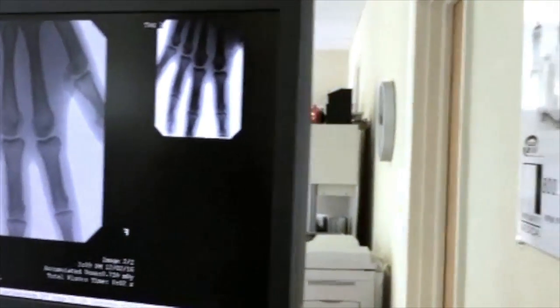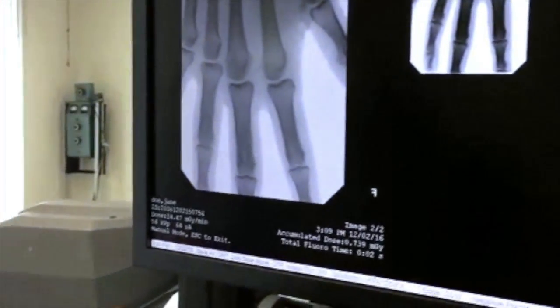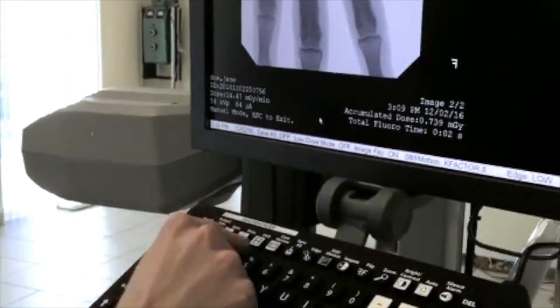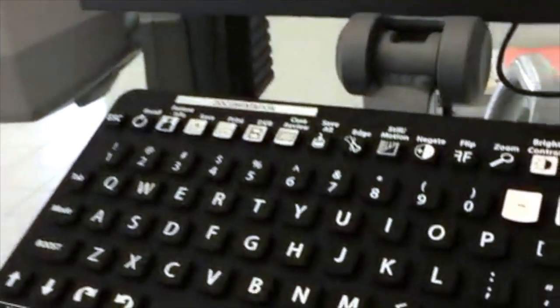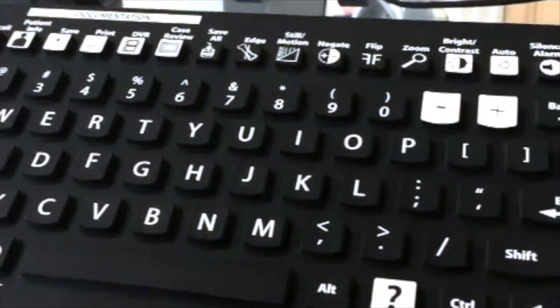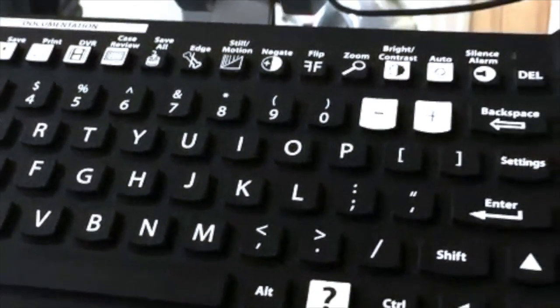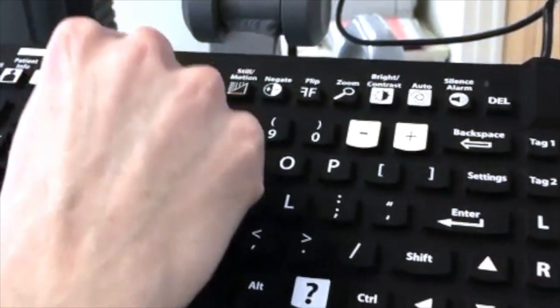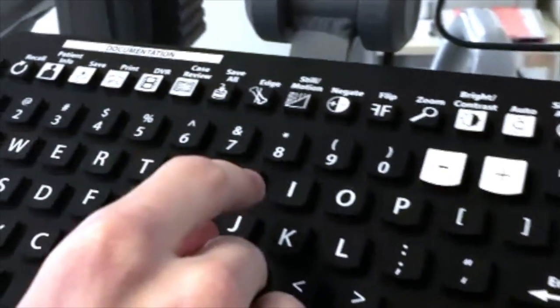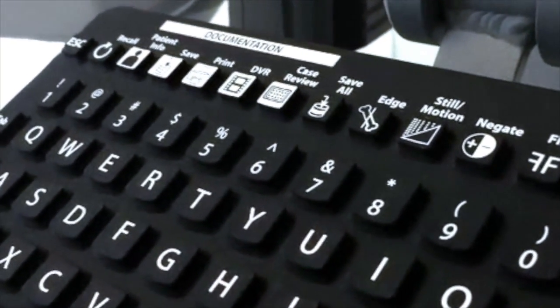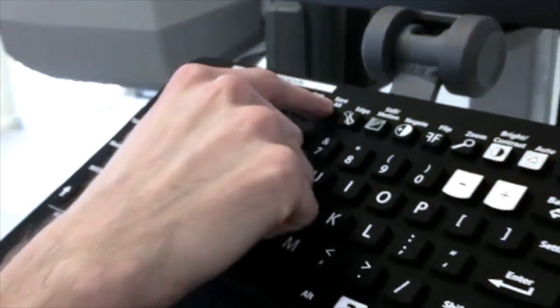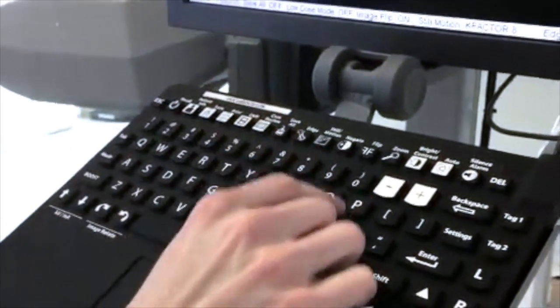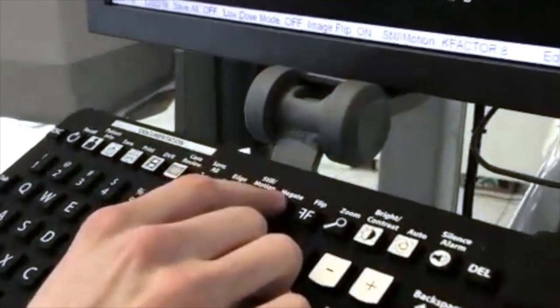After you create an image, you can hit save. It'll save it into the system. If you made multiple images but haven't clicked the save button, you can press save all and it will automatically save all the images. You can use this button to negate the image.